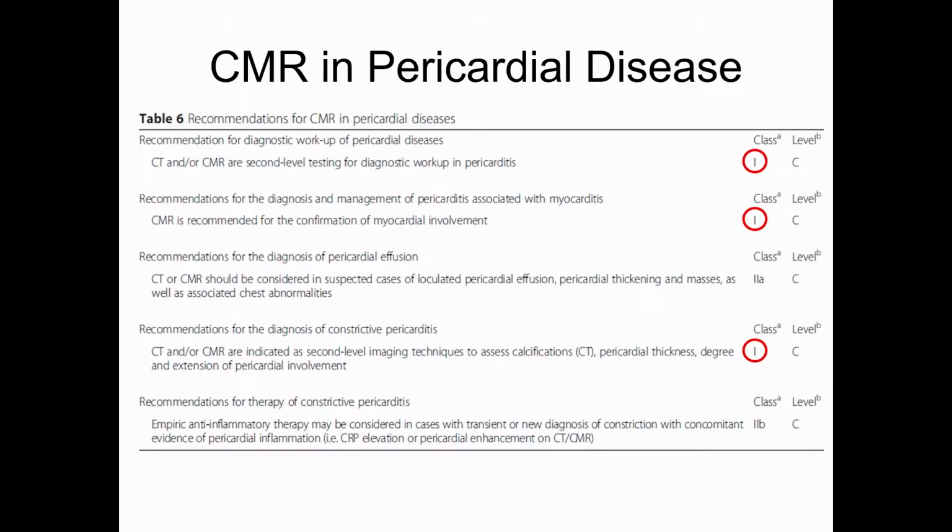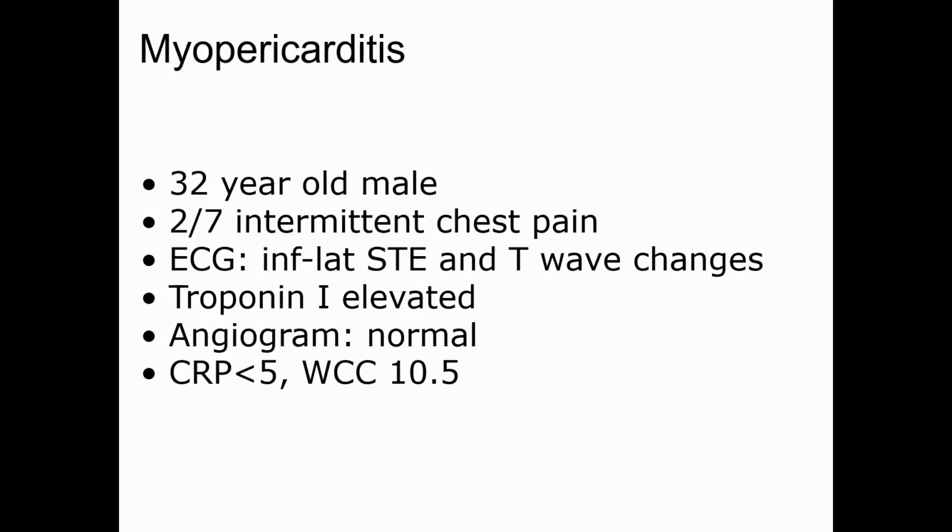Pericardial disease is often difficult to look at. You often need all of the different modalities in these complex patients to see whether they've got constriction, etc. Again, high-ranking recommendations, in parallel to CT, say that you often need advanced cross-sectional imaging, more than just transthoracic echo, to be able to look for pericardial thickening, pericardial constriction, etc., particularly if you're thinking about surgical planning.